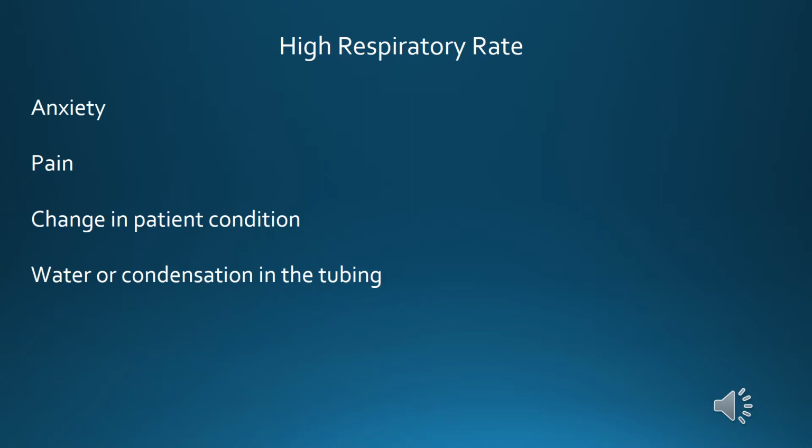That's why you always start at the patient, work your way back through the airway, the tubing, back to the ventilator. Typically, something that does not happen in transporting a patient too often because we use an HME or heat moisture exchanger. But up in the ICU, the heated wire circuits are used with a humidifier.